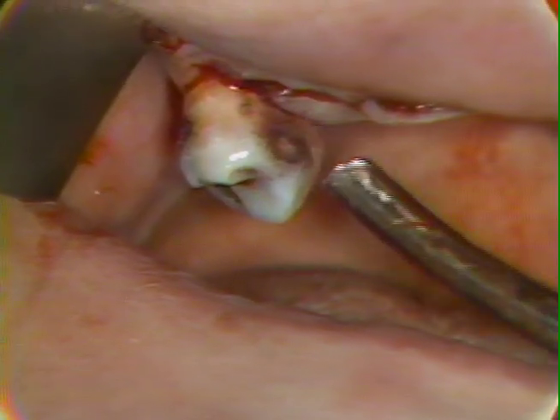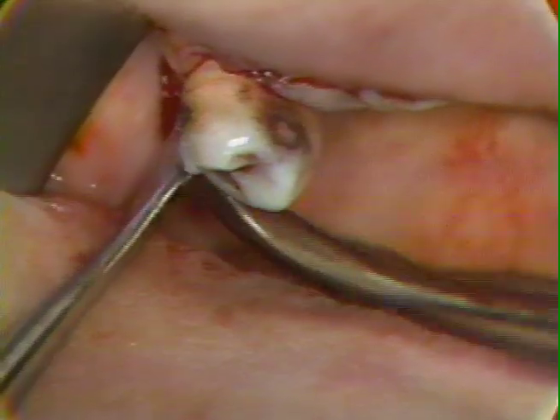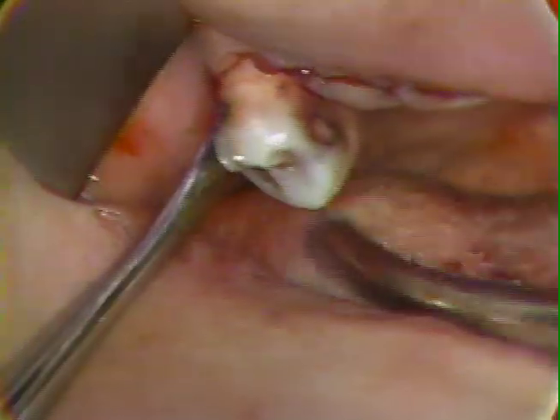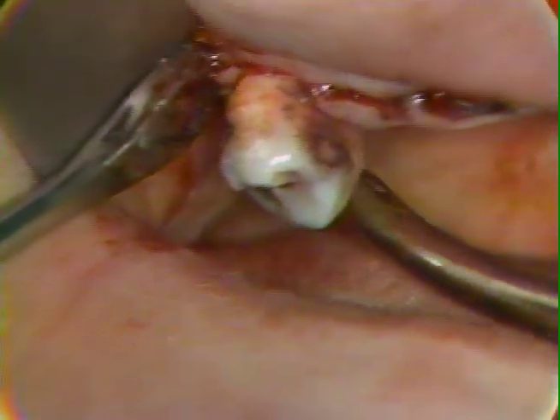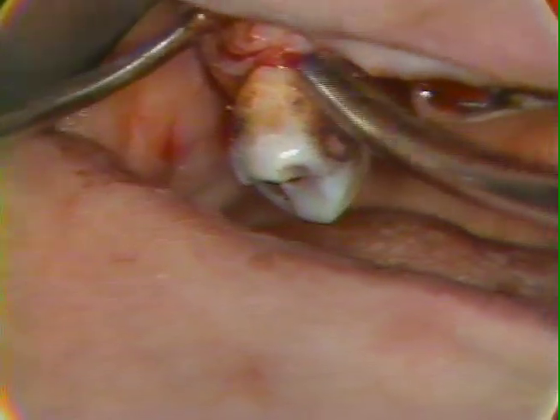So we will follow our incision through the periosteum with the periosteal elevator. We'll try to get down to some kind of a bone plane here that will reflect for us so that we can get this buccal plate exposed.